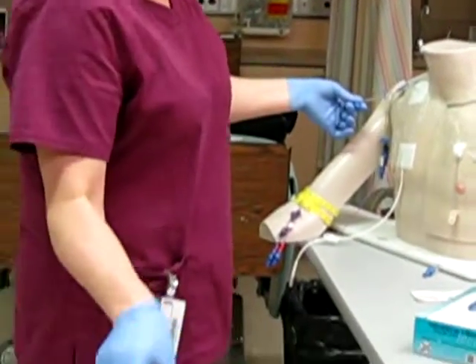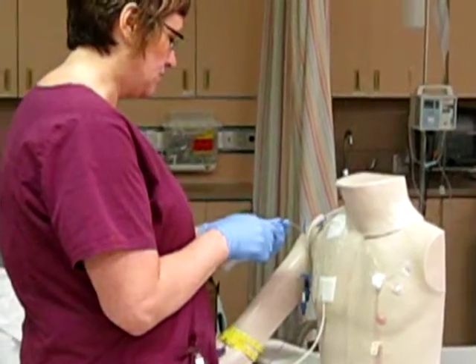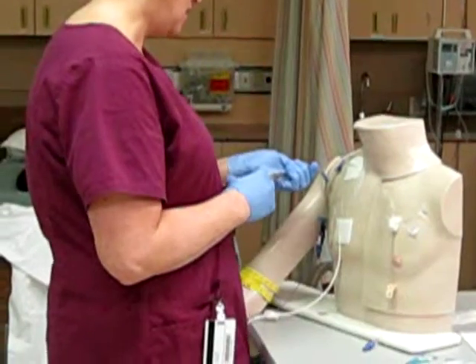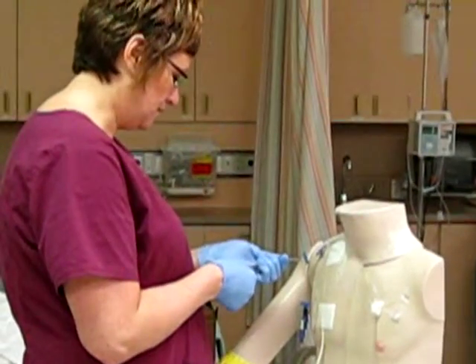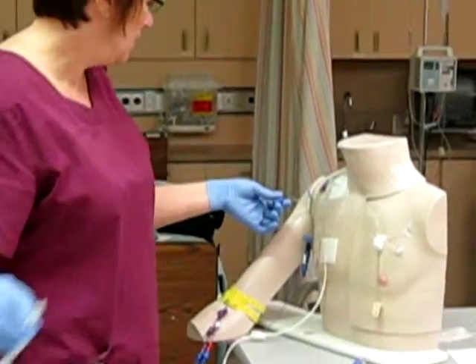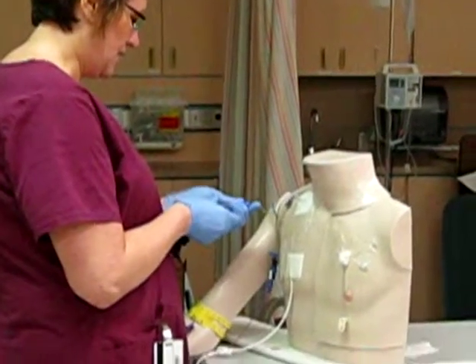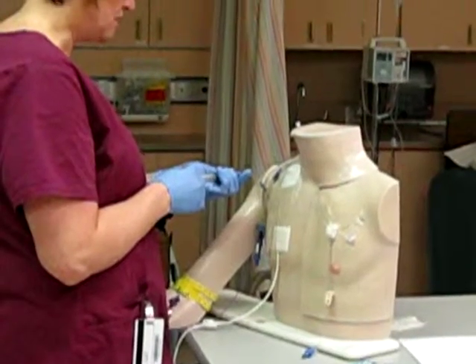And then I'm going to do the normal saline, and I'm going to insert the normal saline at 3 to 5 minutes, the same rate as I gave the drug. And I'm going to screw that, and then I'm going to give the heparin flush.